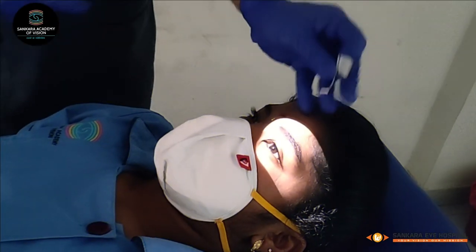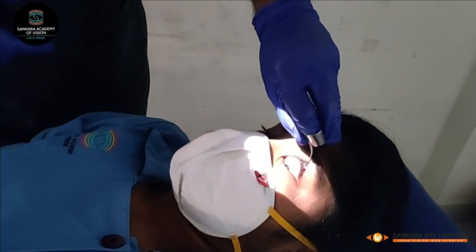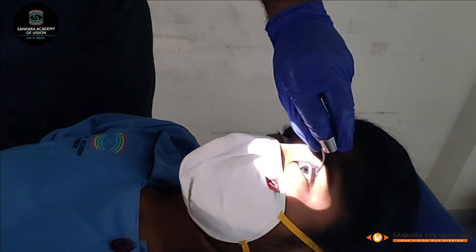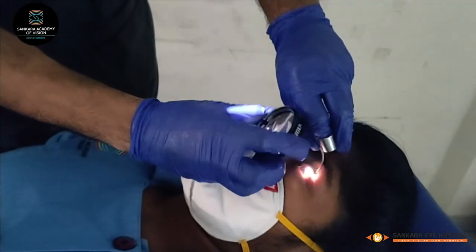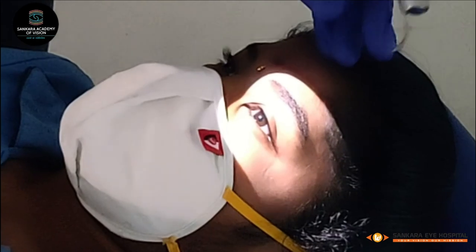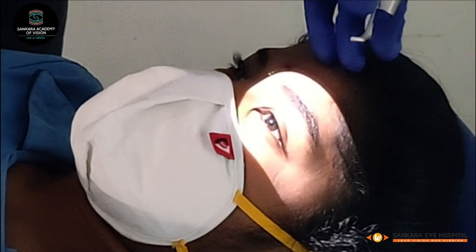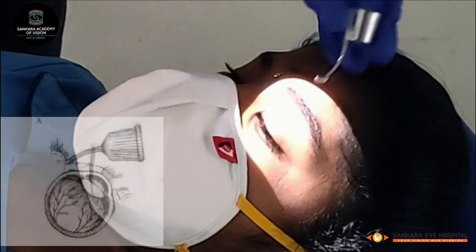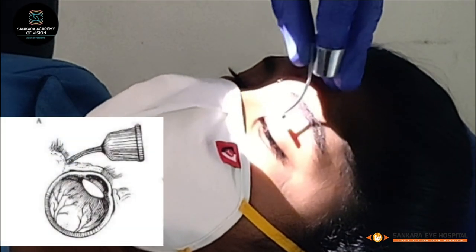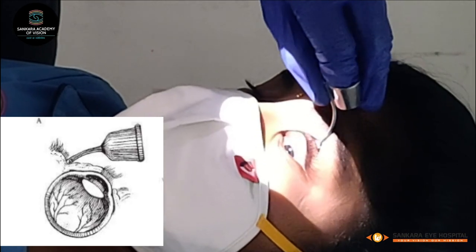Scleral indentation is an important technique for the examination of peripheral retina. The two key principles to observe are appropriate placement of the indenter and to indent in the correct direction. To position your scleral indenter, first ask the patient to look in the direction of gaze that is opposite to the area that you want to indent. Then place the indenter in the skin crease and gently slide it backwards over the globe.